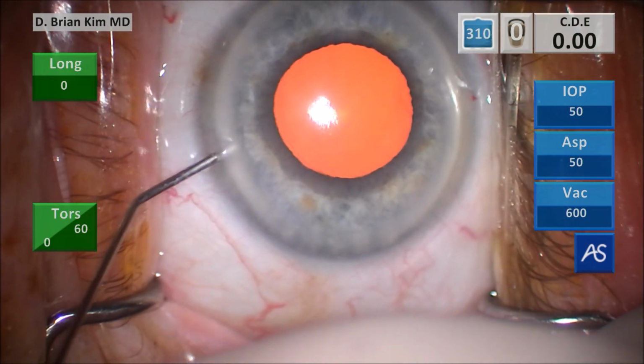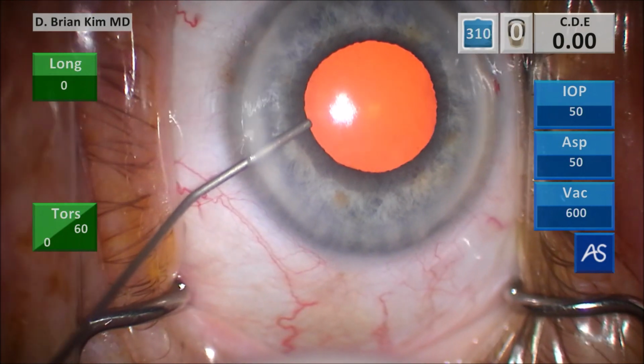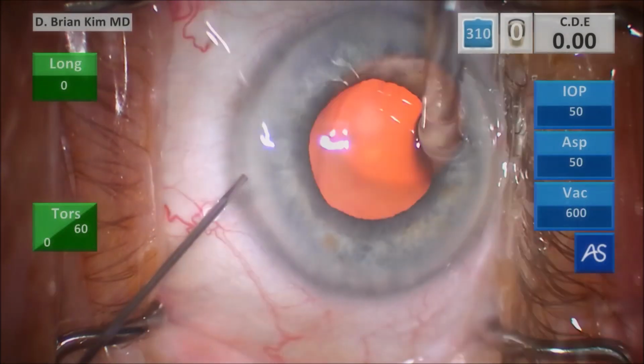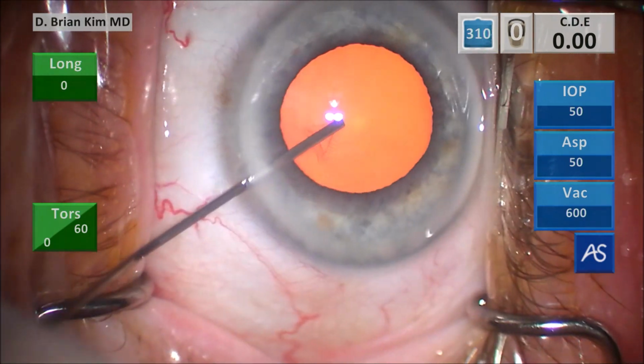This is intracameral lidocaine, and then some intracameral epinephrine, and then now some dispersive viscoelastic. Of course, the viscoelastic provides some viscodilation.